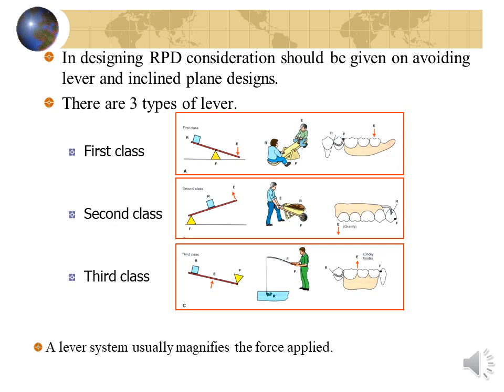A lever in its simplest form is a rigid bar, supported somewhere along its length. It may rest on the support or may be supported from above. The support point of the lever is called the fulcrum, and the lever can move around the fulcrum. There are three types of lever. Each lever modifies the intensity of the force acting on the denture to a different degree.